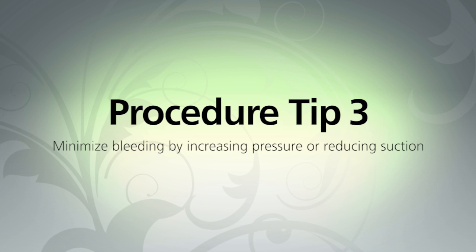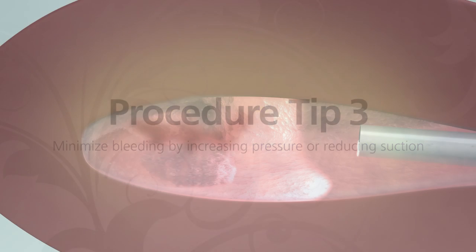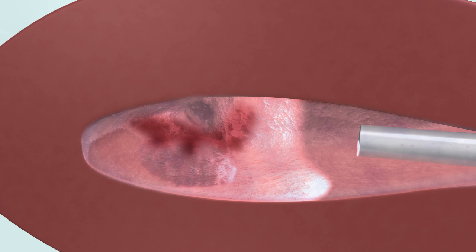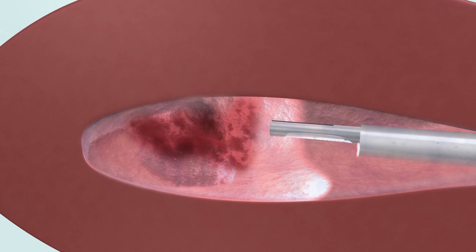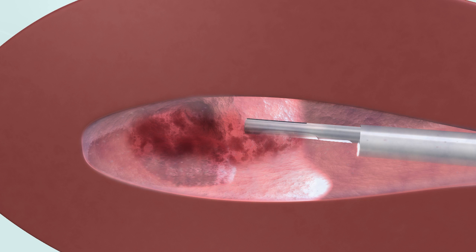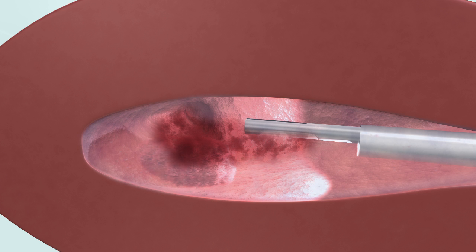If bleeding occurs, extend the Myosure device past the scope and wait a few seconds for the fluid to circulate through the closed Myosure window. The closed window still has a small area around the blade for outflow.